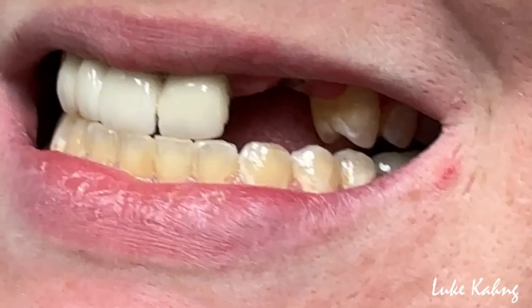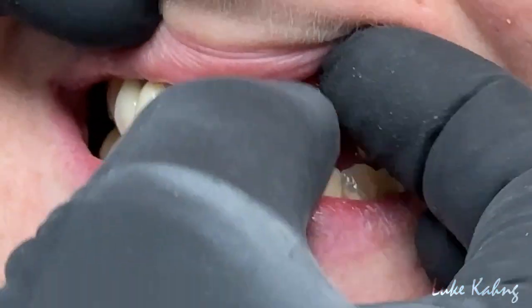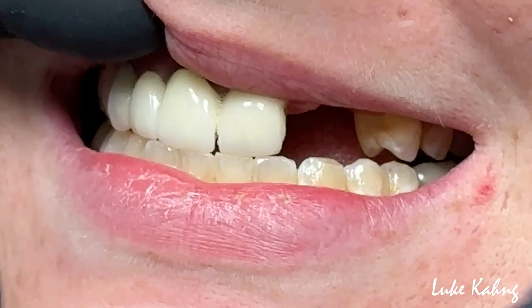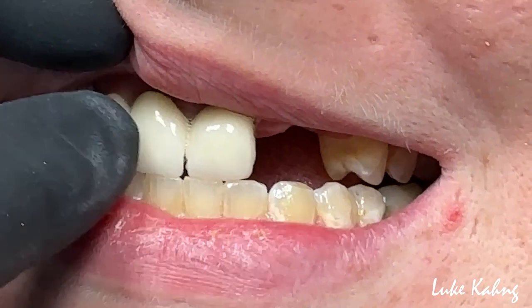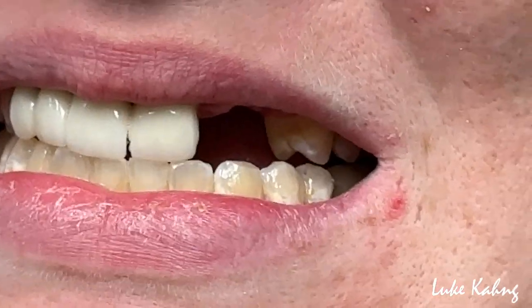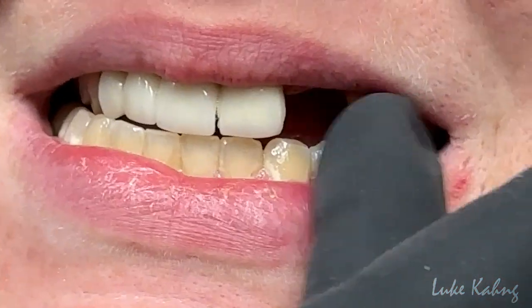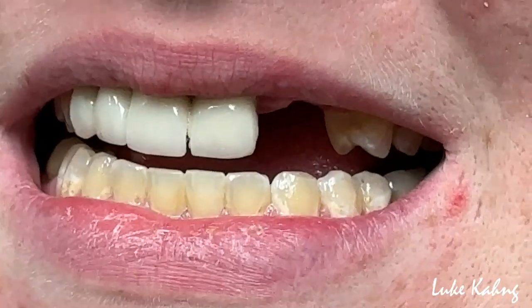Okay, can you do edge to edge? Okay, good. So it looks like this edge is in a good position — a very good position. I'm going to make the same height compared from the gingiva all the way up. The contour is zigzagging — contour is too different. So I have to make a better shape and contour from the gingival areas, making the right height of contour. The canine will be a little longer because when you move the canine to the side, I want to get a little more touching here — just like here — maybe a little bit off because this is the implant.